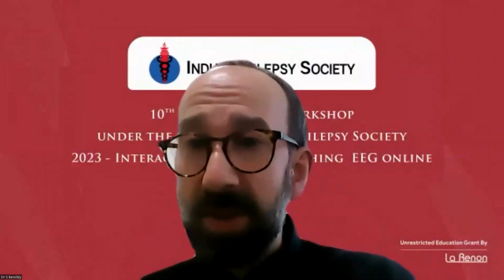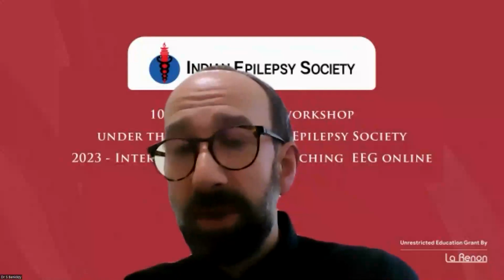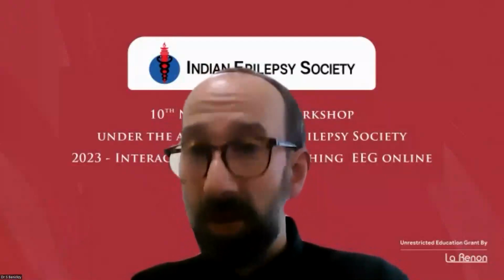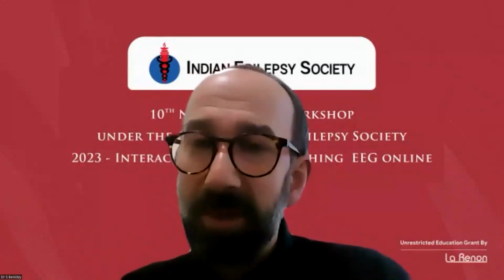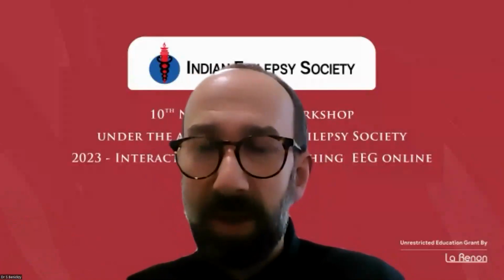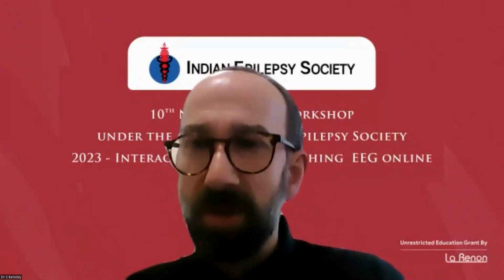Yeah, so basically you need some adaptations here, because although the same principles apply, you would have some special circumstances, like perhaps there are some areas on the scalp which you cannot cover because you don't have place where to put your electrode, or you have a breach rhythm or a breach phenomenon which gives you a much higher amplitude, and then you have lots of rhythm. But again, there the same principles apply because you look at the evolution of the rhythm. But again, if you are not well trained and then you say, "Oh, this is spiky and it's big," then that's not enough to call it a seizure. You need to see also this evolution in time and space. So basically the same principles apply, just take into account that your spatial sampling is different, and then take into account also this breach effect.